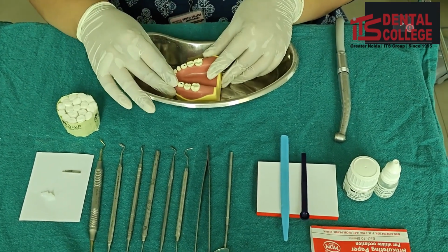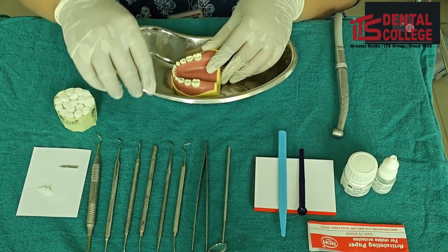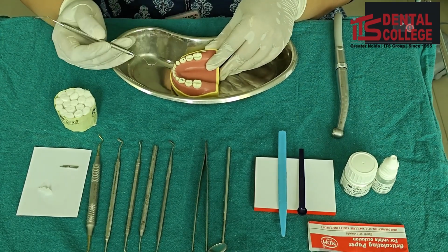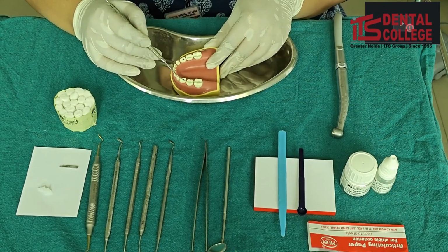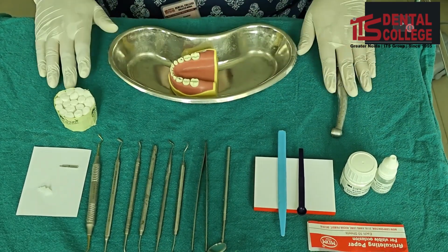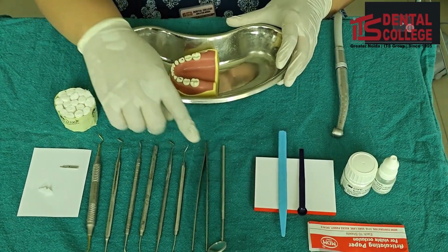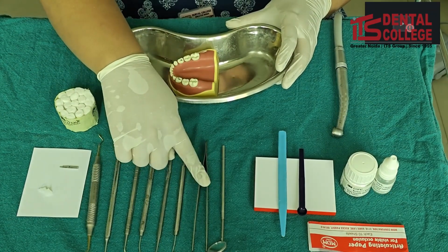Now the cavity for a glass ionomer cement may be conservative. It has to be limited only to the carious part of the tooth and no additional retention will be required since this material bonds chemically to the tooth structure. For preparing the cavity, we will need an air rotor, a small round burr, a straight burr, and a diagnostic set, that is a mouth mirror, an explorer, and a tweezer.